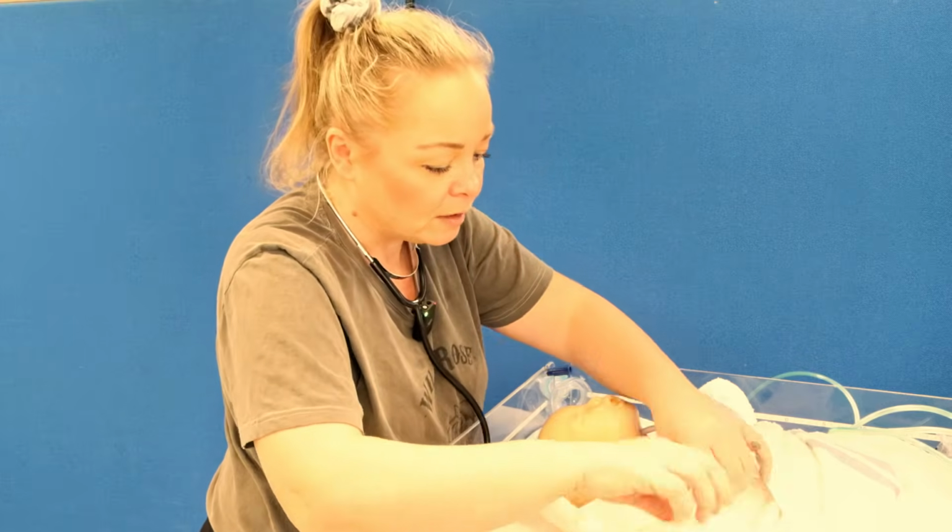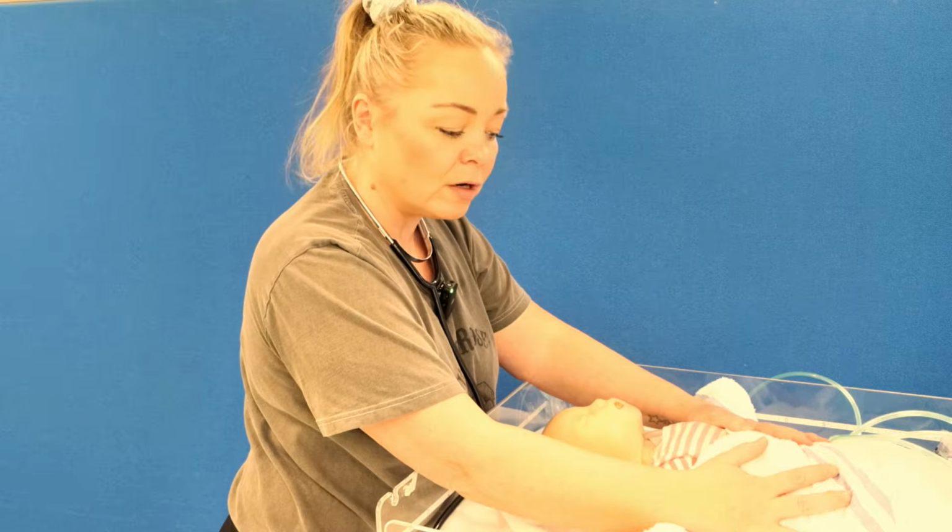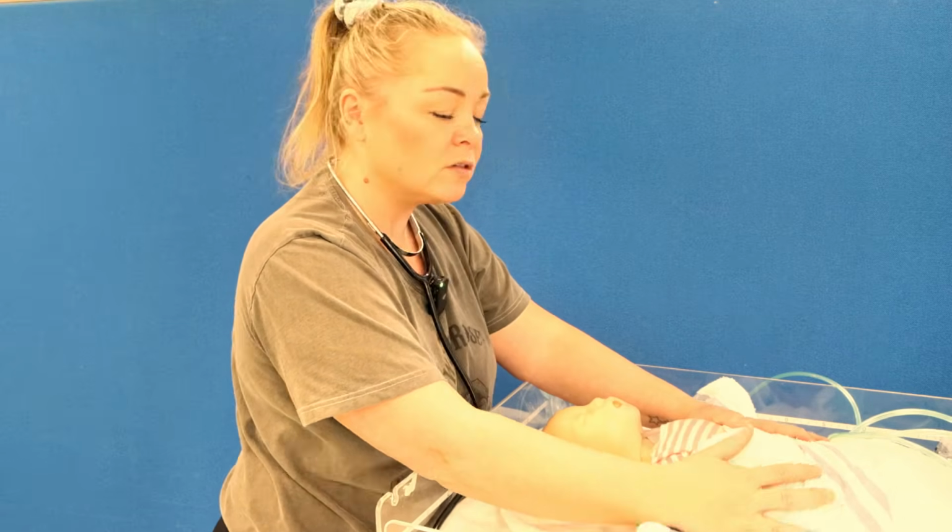So I'm going to pop their little SATS probe on, and I'm just going to monitor them for a little bit longer on the resuscitator, and then place them with mum for skin to skin. And then I'm going to document, debrief, and datex.